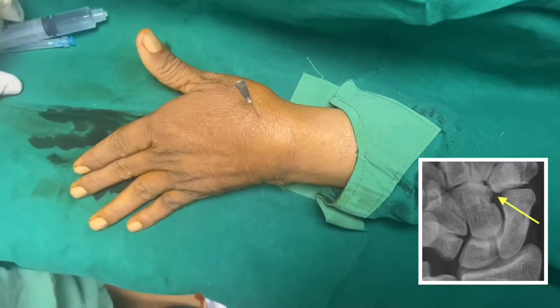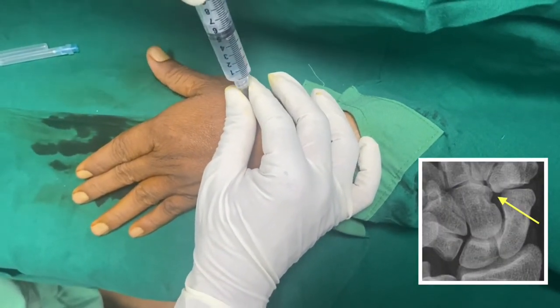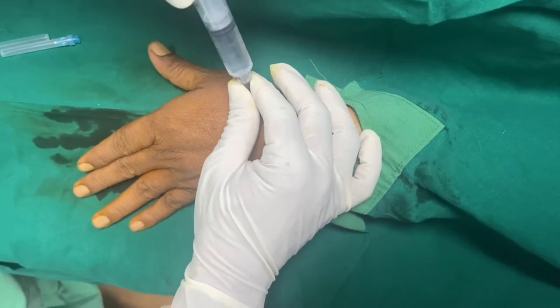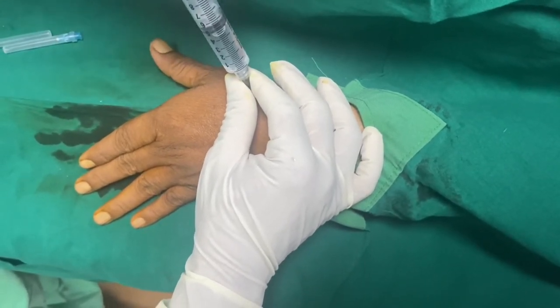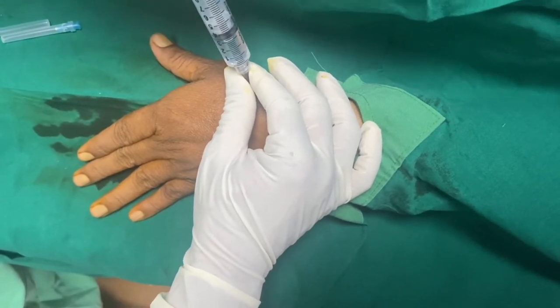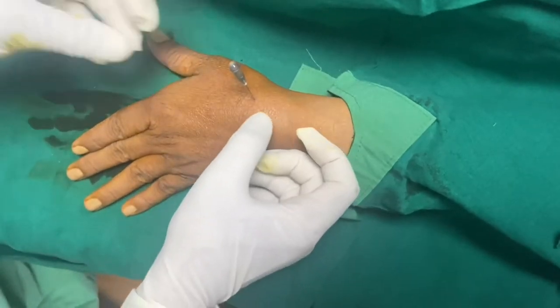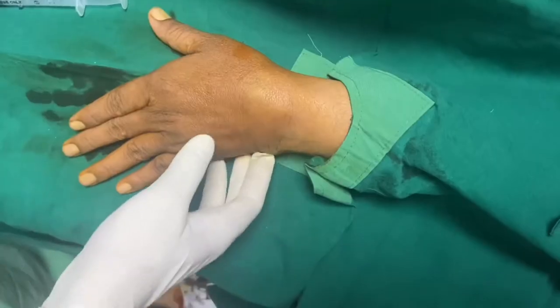Now I am in the space, so I am going to aspirate 2 ml and pass 2 ml of dye into the joint. When there is a backflow, that means the needle is in the joint.